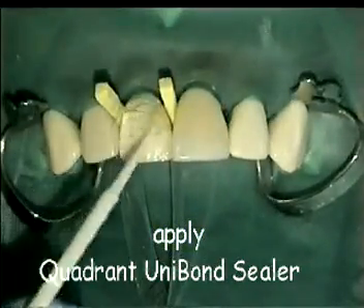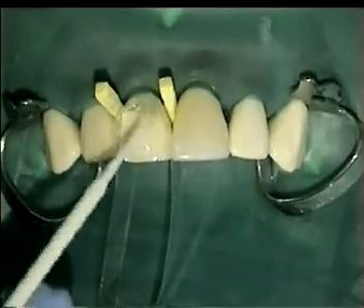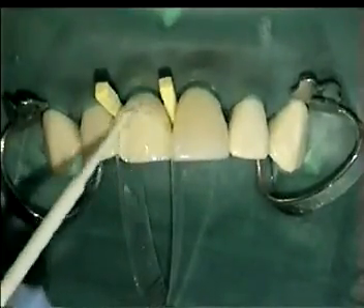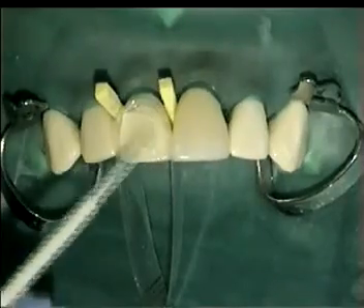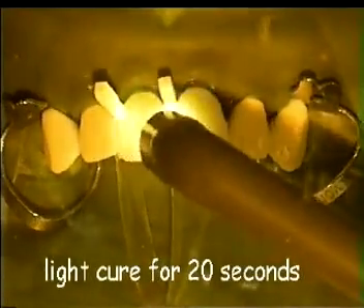Apply Quadrant Unibond sealer. Light cure for 20 seconds.